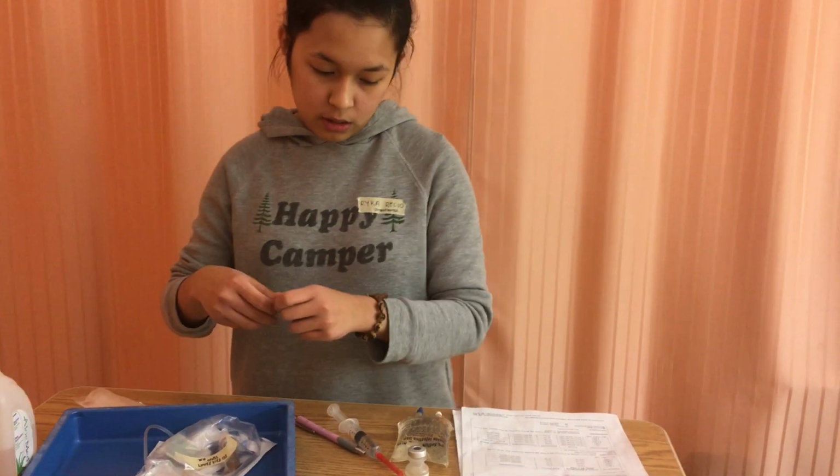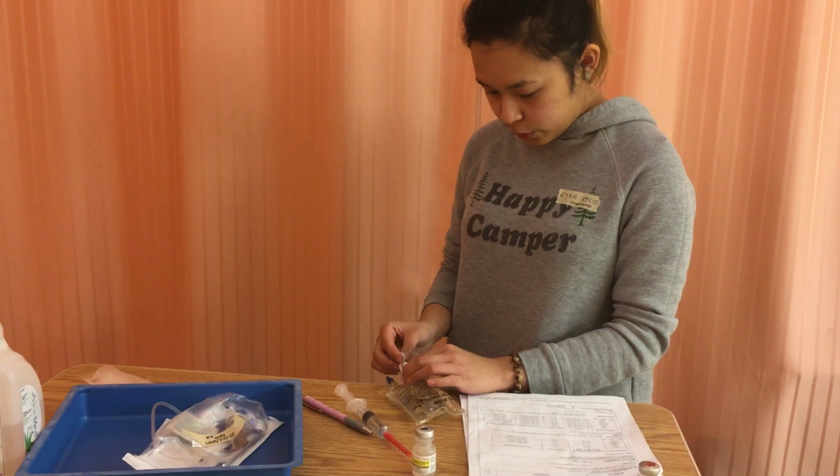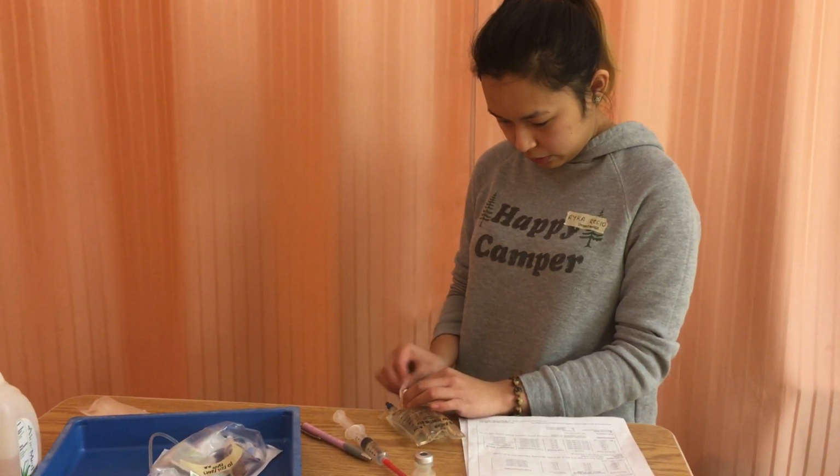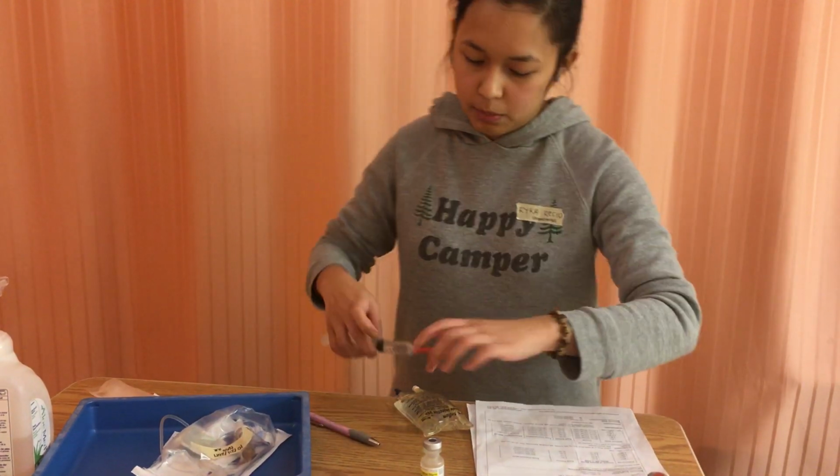So I'm just going to swab the injection port for 30 seconds and let it dry for 15. Going to dilute.